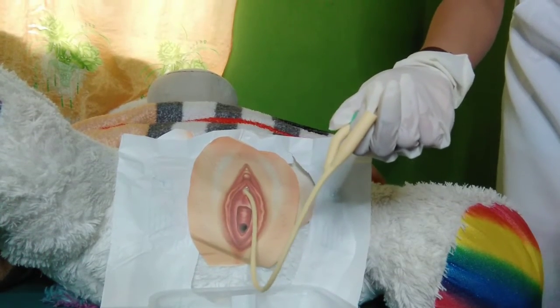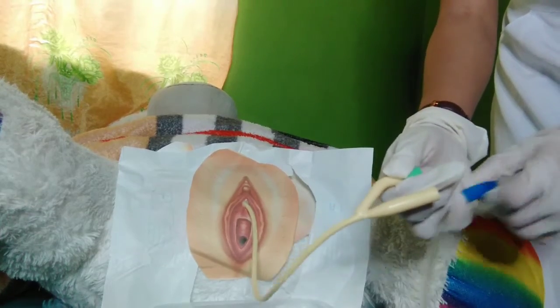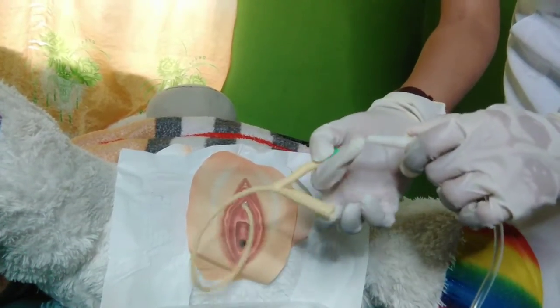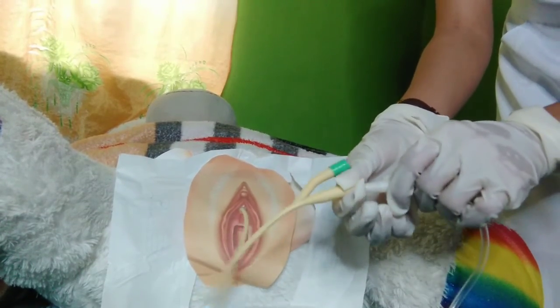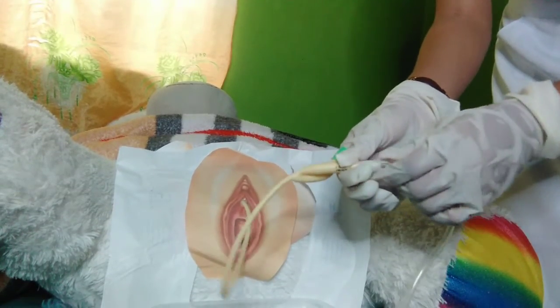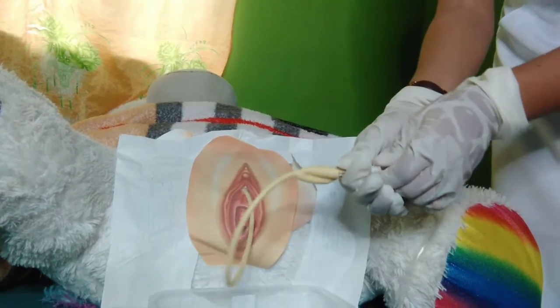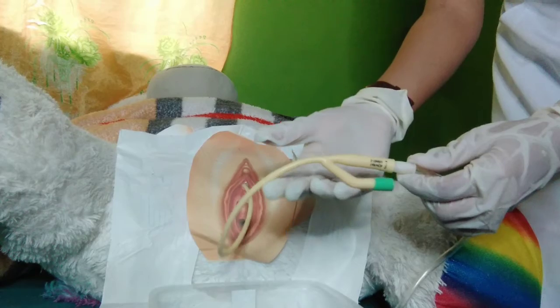So connect the urinary bag to the catheter using the sterile technique. Keep the urinary bag below the level of the patient's bladder.